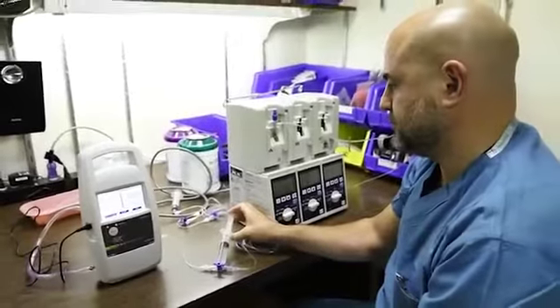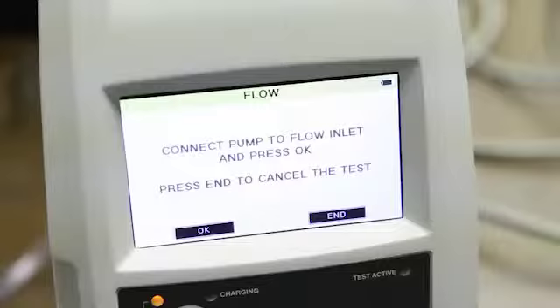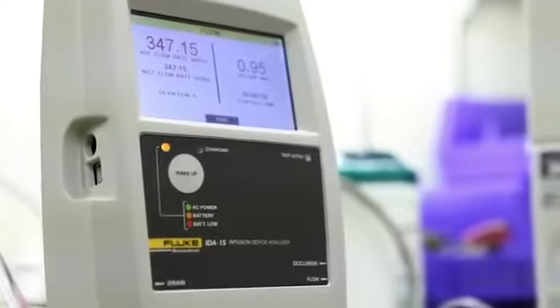It's as simple as that. You have a touch screen, it's really easy to navigate. Being a Biomat, you always have to go really fast. So equipment like that helps you in a big way.